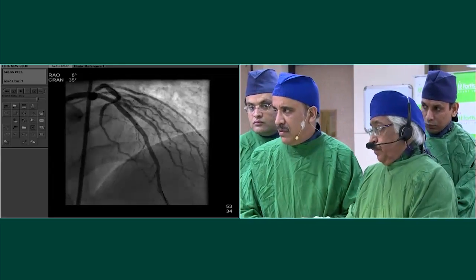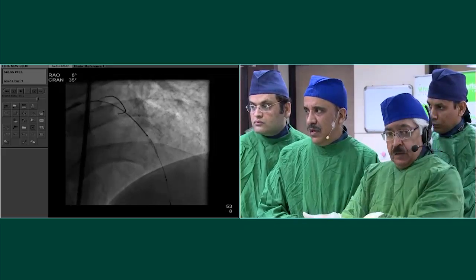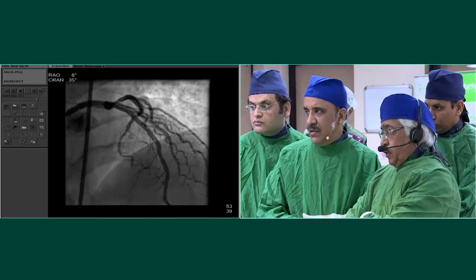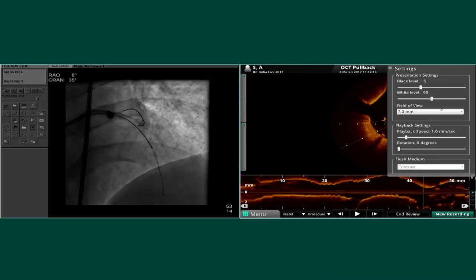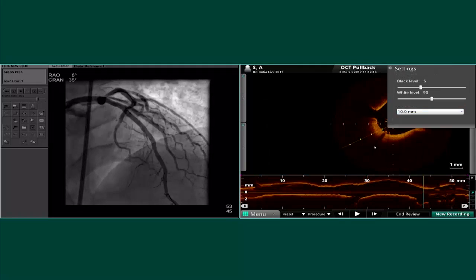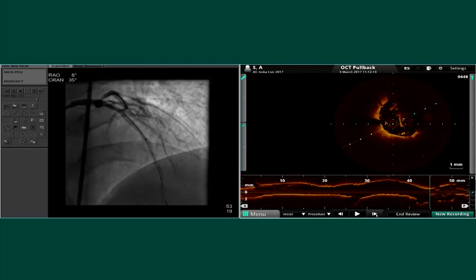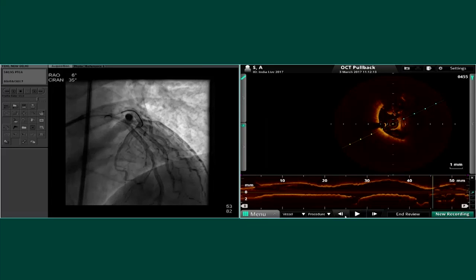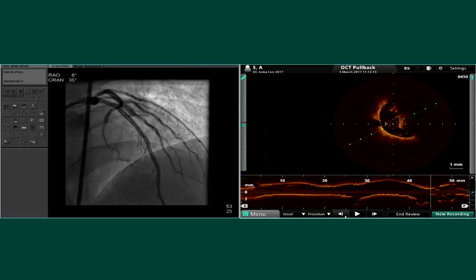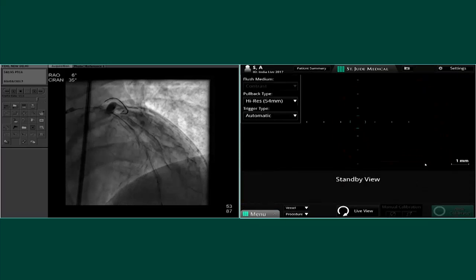Watch this. Can we see the OCT, please? You're watching, we are not watching. Can you show them the OCT, and the most proximal? And just come to the left main. Yeah, the proximal. Oh gosh, there's too much flush that missed out the struts. Okay, go distally slightly. No. Take another one.